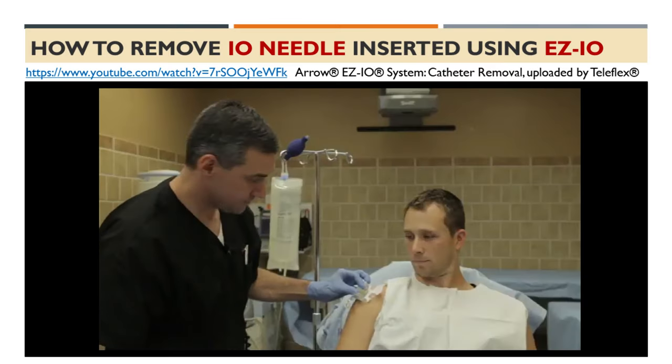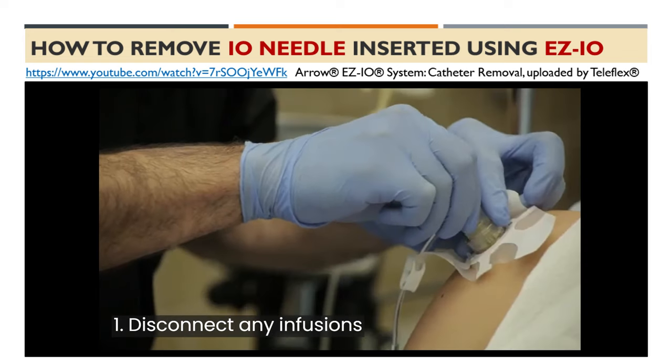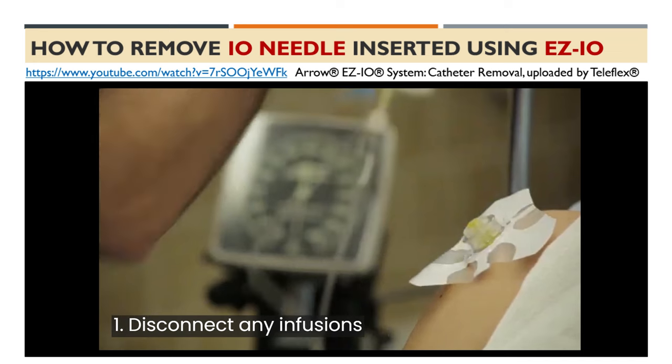Now, let's review the removal process in this video. Step 1: Disconnect any infusions connected to the I.O. catheter.